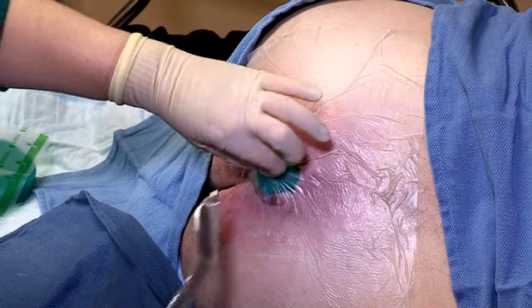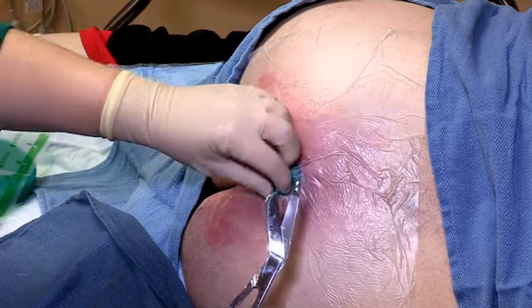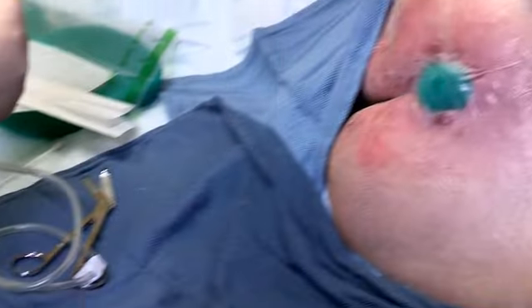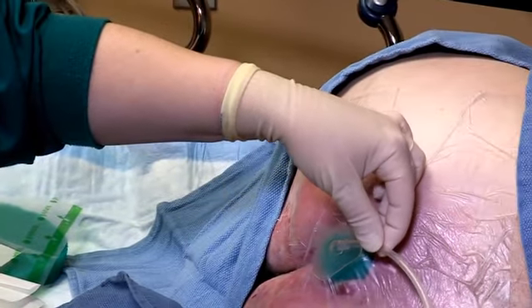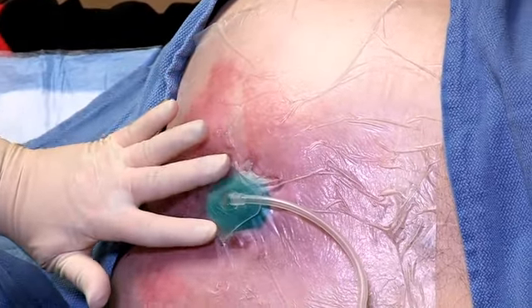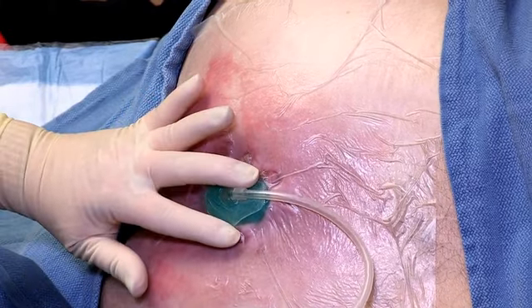To apply the transfer pad, cut a hole in the film that is 1 centimeter in diameter. Do not cut a slit or an X. Remove the protective release film from the transfer pad. Consider the preferred direction of the transfer pad tubing in relation to the patient's body and the position of the NPWT device. Center and apply the transfer pad directly over the hole in the film. Press gently to fixate the transfer pad on top of the film.